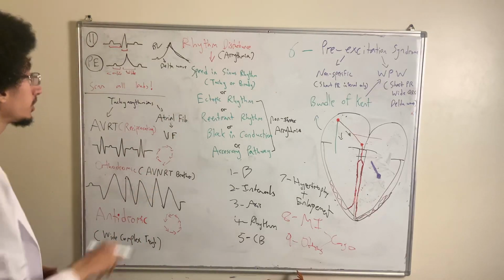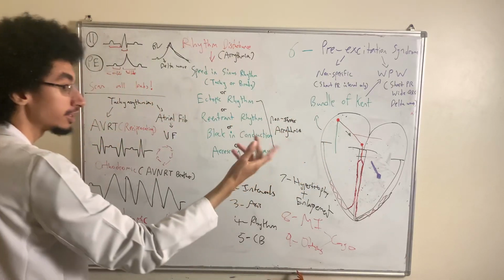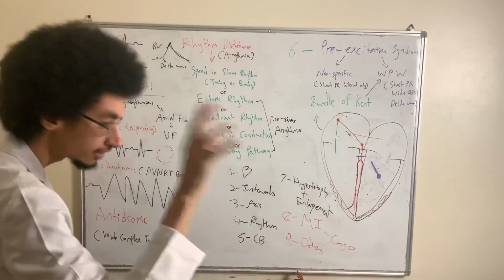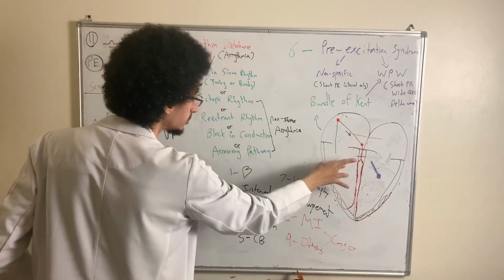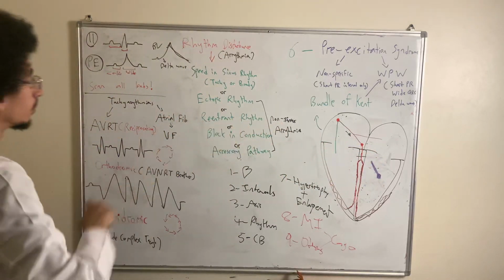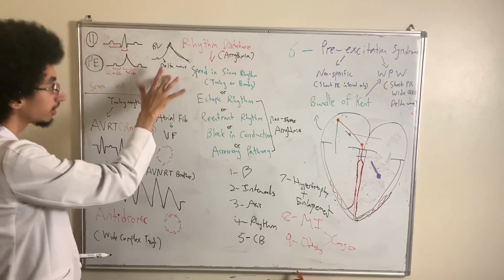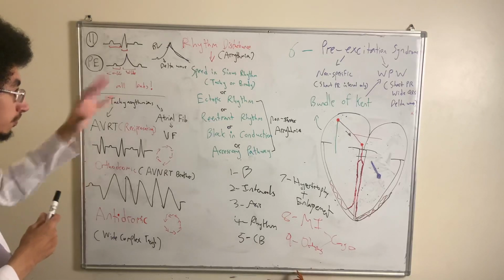Not like normally. In a normal case, you will have a wave of depolarization only coming from the AV node, and from the AV node it will come down and it will depolarize both the right and the left ventricle equally in terms of timing, equally. But in the case of Wolff-Parkinson-White syndrome, we will depolarize the right ventricle first, very early, and then shortly afterwards we will also depolarize the left ventricle. So it will give us a widened QRS complex thanks to the contribution of this delta wave, which represents specifically early depolarization of the right ventricle. Mumtaz? So that's pretty much it for Wolff-Parkinson-White syndrome.